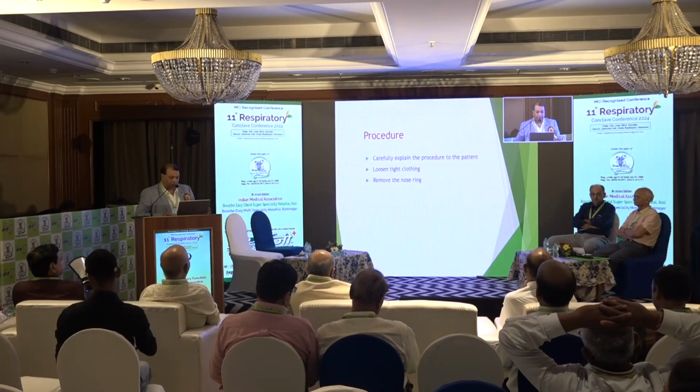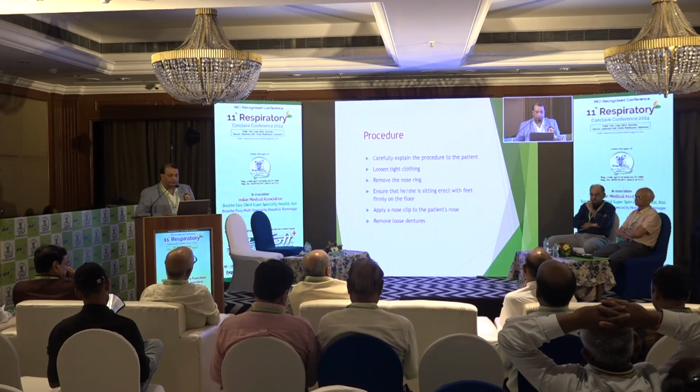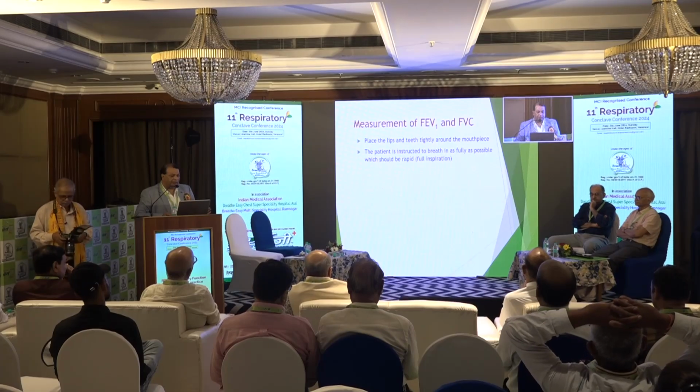The subject should be seated approximately 5 minutes prior to the test, and should remain seated throughout the investigation. Sit upright on a chair with arms and backrest. The procedure: carefully explain the procedure to the patient, loosen tight clothing, remove nose rings, and ensure that he is sitting in an erect posture. Apply the nose clip on the patient, and remove loose dentures. Place the lips and teeth tightly around the mouthpiece.